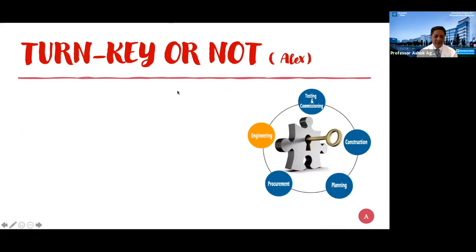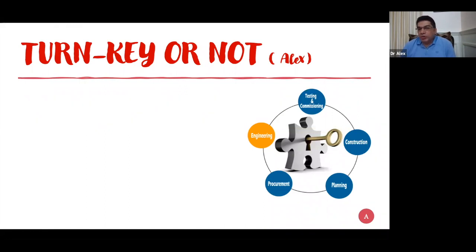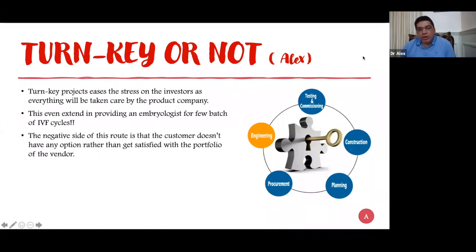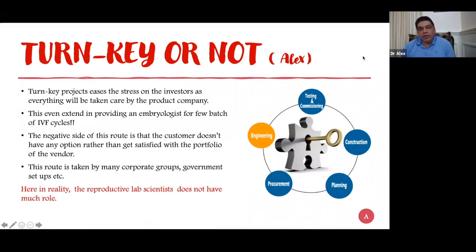Alex. Yes, thank you. Turnkey projects are very common, especially in the Southeast Asian countries and also for chains of clinics. This becomes easier for the investor when it comes to setting up the unit. The whole thing will be taken care of by this particular company. The only negative aspect is that this company might provide only the kind of equipment that they deal with.